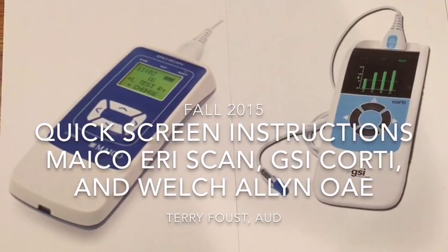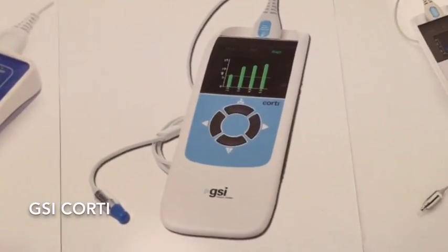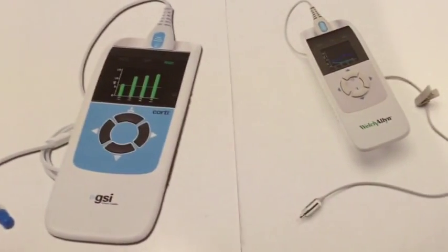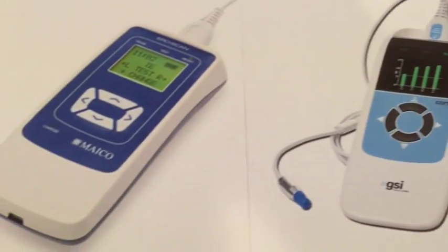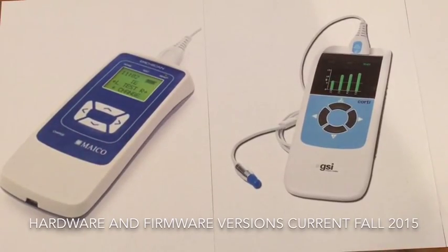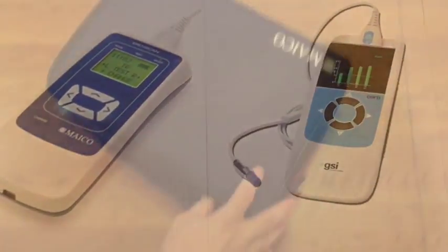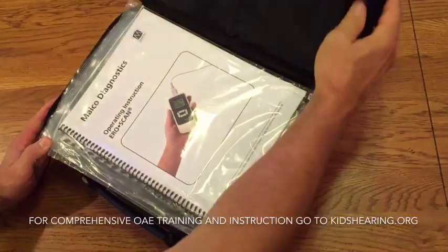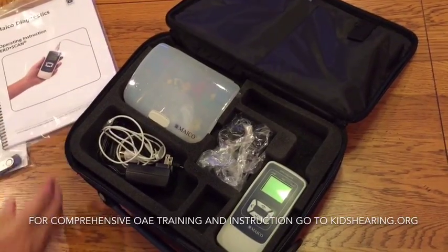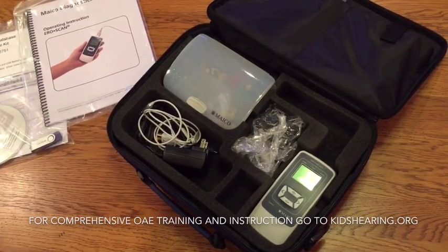This instructional video provides quick screen instructions for the Maico Ero Scan, the GSI Corti, and the Welch Allyn New Generation OAE Screener — essentially the same piece of equipment packaged and branded for various companies. The hardware and firmware versions are current as of fall 2015. While we will be using the Maico Ero Scan for this video, all parts and basic operations are the same for all three pieces of equipment. Think of it as the cliff notes for your particular brand of screening equipment.